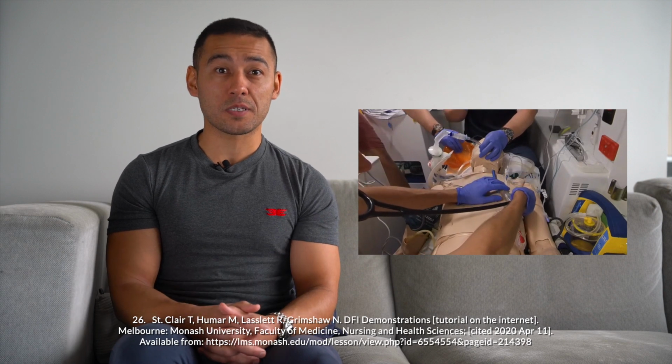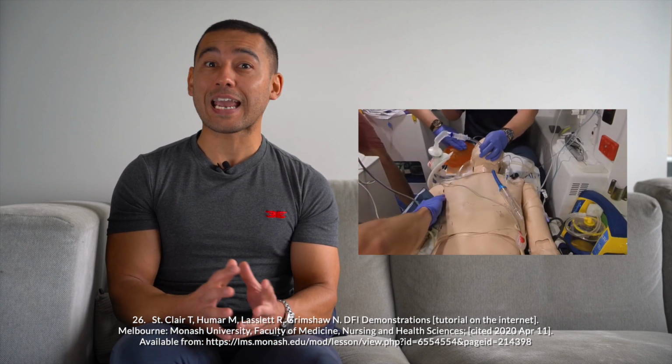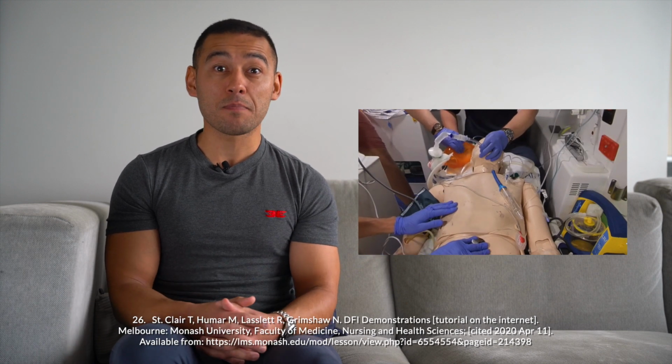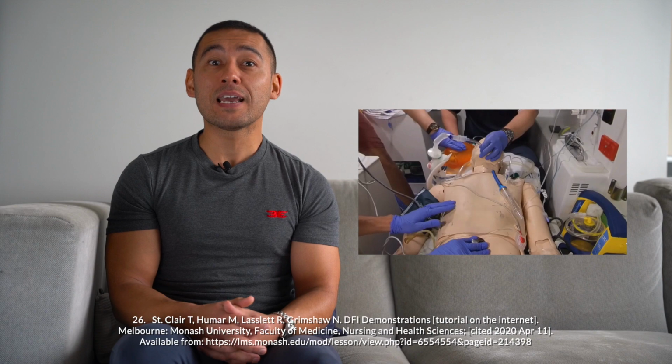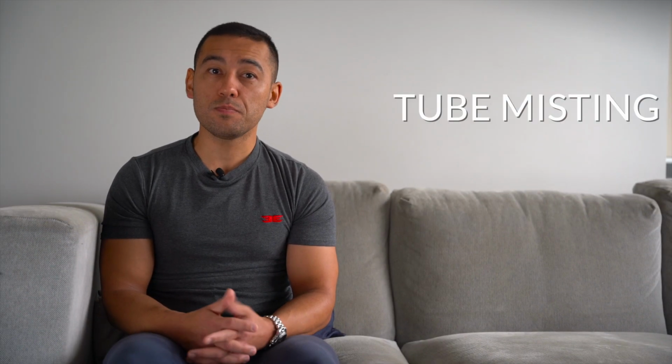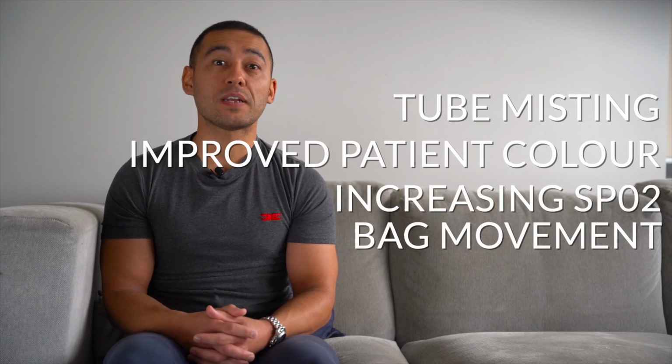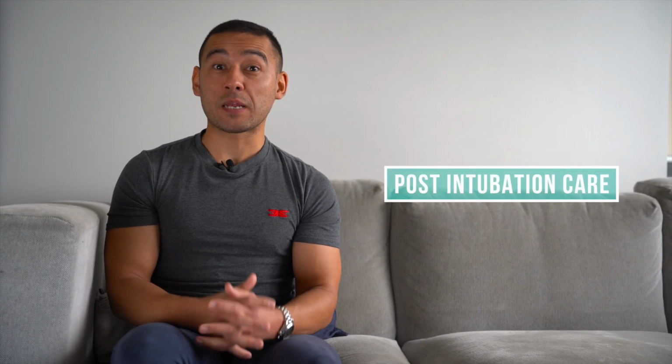When listening to the chest, unequal air entry can be a sign that the ETT is too deep, most often down the right main bronchus. When listening to the epigastrium, bubbling sounds and an enlarging abdomen can indicate esophageal intubation. As ventilation continues, tube misting, improved patient color, increasing SpO2 and bag movement in the spontaneously ventilating patient may also be observed. Once tracheal intubation has been confirmed, it's time to turn our attention to post-intubation care.